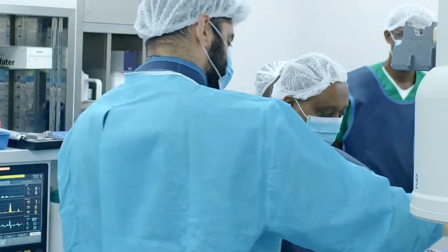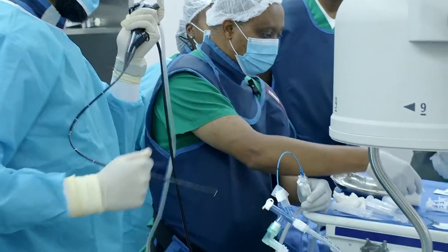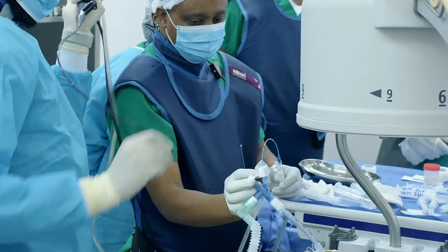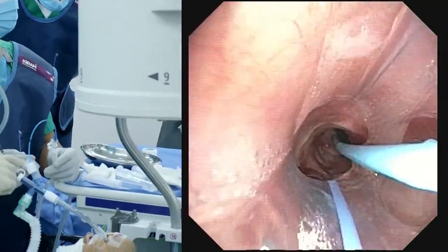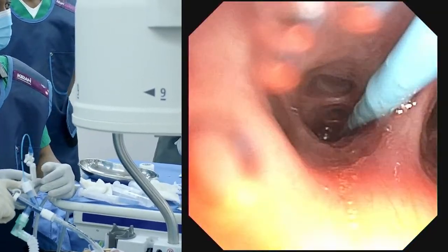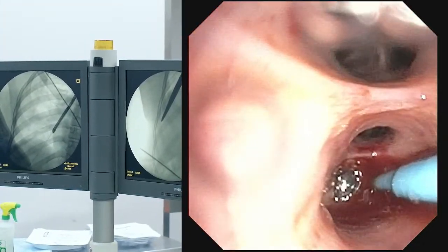Because you can tear the bronchus with this, it's quite powerful. And if you've ever used this in the pleura, it does tend to be quite strong, this thing. So we're going back in now. There you go. Nice placement. Very nice. I'm going to deflate it a bit.